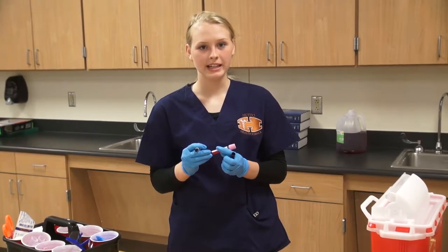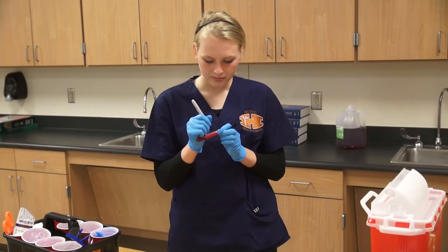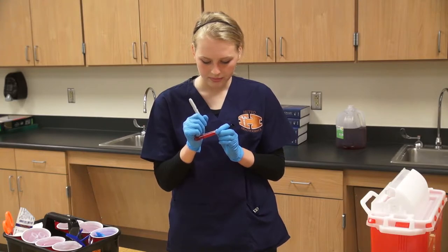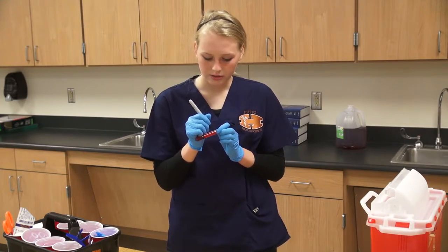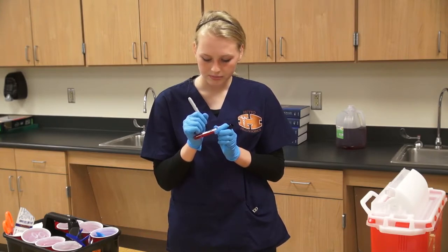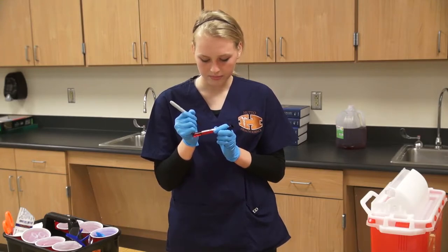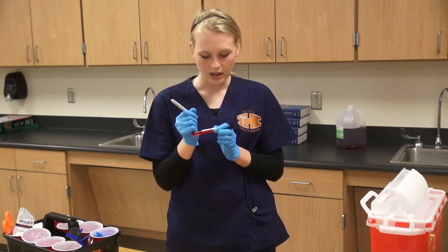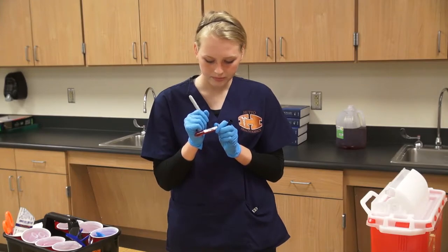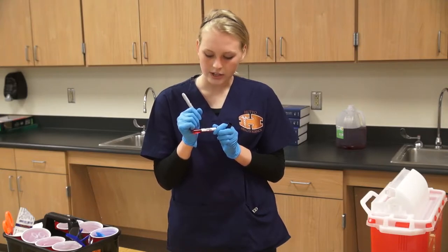Before allowing the patient to leave, you need to obtain their information and write it on the vacutainer. This will include their name, date of birth, their physician, the time of the draw, the date, and your initials.